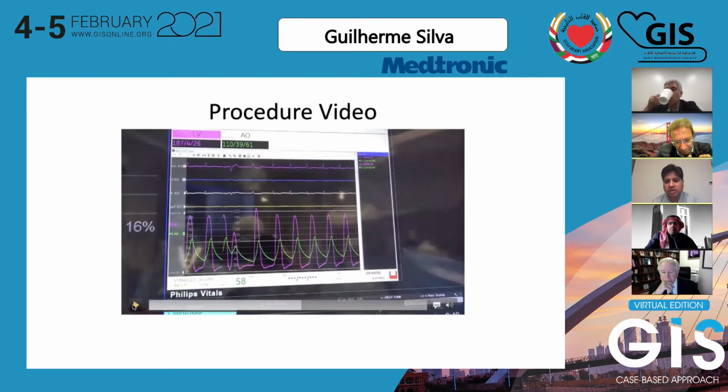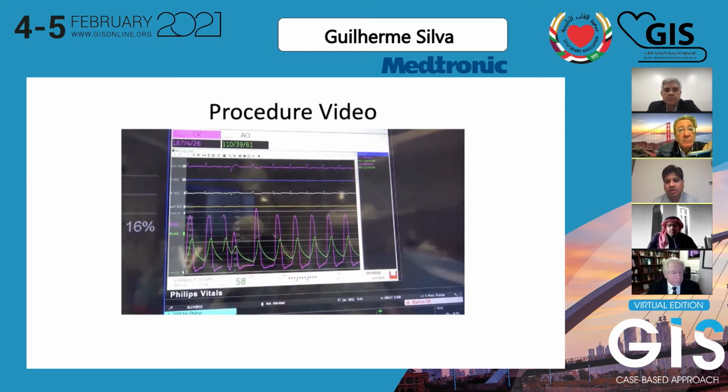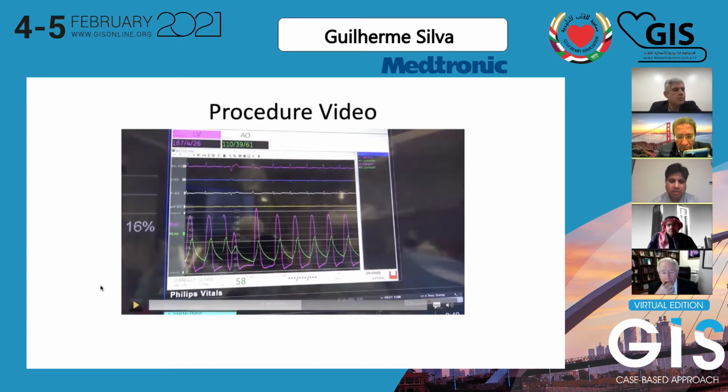When they go back into atrial fibrillation, you assess all 10 beats and average them, and we got close to 44 as a mean gradient, which is still high. But what really matters is when you have a higher stroke volume with an ectopic beat, you have to take the same LVOT after the ectopic beat or a bigger stroke volume to do the dimensionless index. Now, coming back to this particular case, we really have to make sure the coronaries are not closing off because of the smaller annulus, and the distance from the ring to the coronary ostium should be at least 6 millimeters.